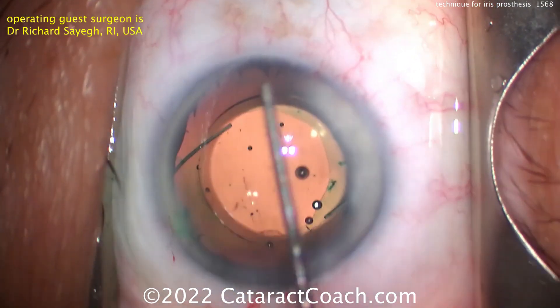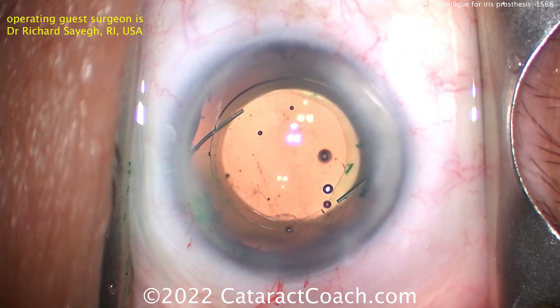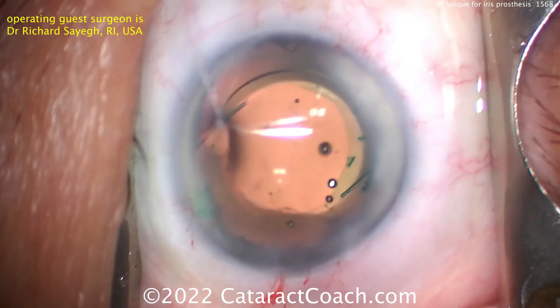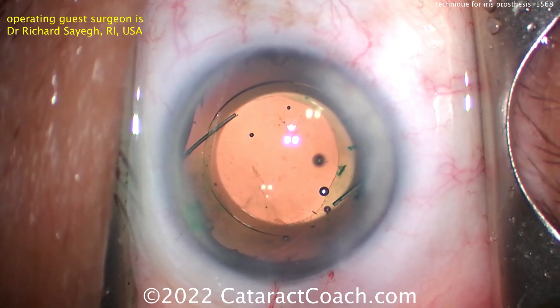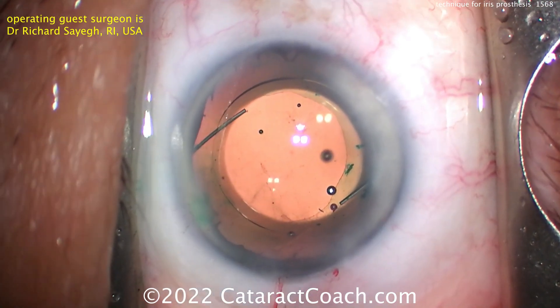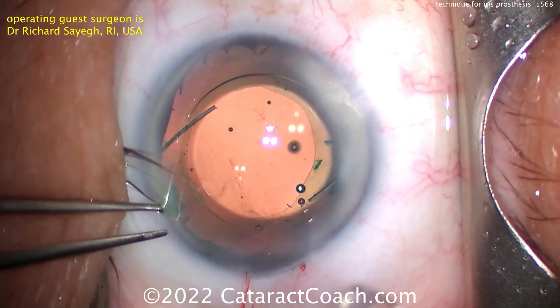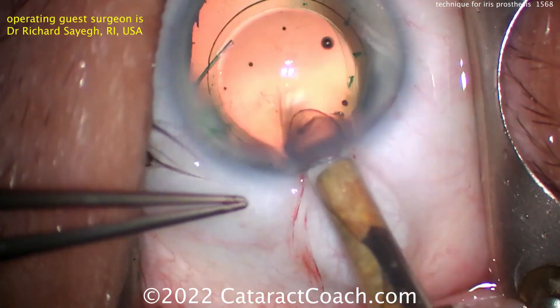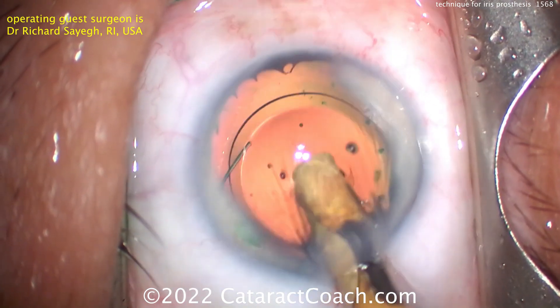The rhexis is a good size, about 5 to 5.5 mm, which is great. Arguably, in a case like this, you may make the rhexis even bigger — because you're going to have the prosthetic iris in the capsular bag as well, and it has about a 4 mm pupil. So even with a 6, 6.5, or 7 mm rhexis, you'll still protect the optic and keep it within the capsular bag, since in front of the optic is this big iris prosthesis.